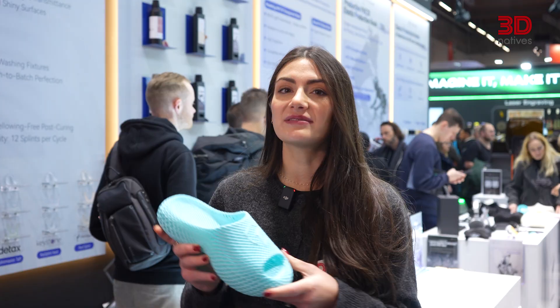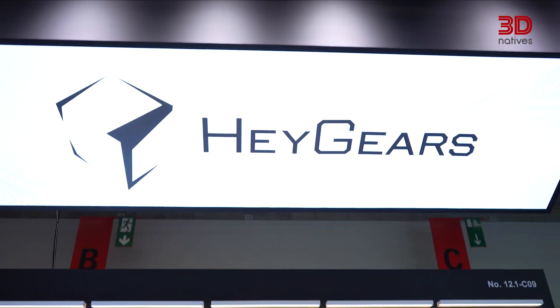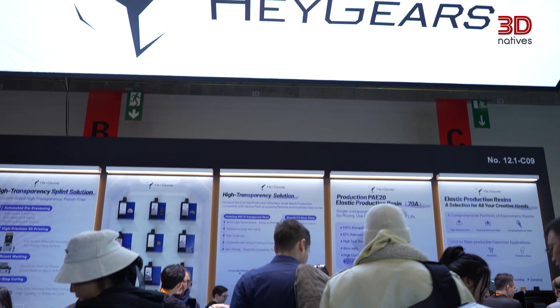What can resin 3D printing really do today? HeyGears is giving us a first look — from ultra clear parts to full multi-material dental prints. HeyGears has built a strong reputation in resin-based additive manufacturing, focusing on systems where the hardware and materials evolve together. This year, they're introducing the Reflex II series, designed for high clarity and elastic applications.